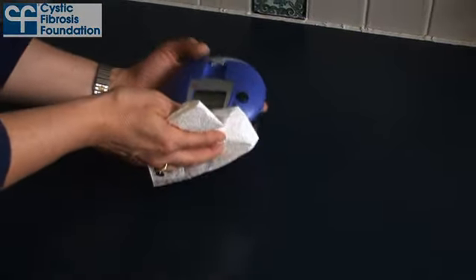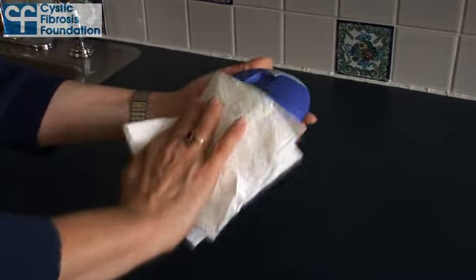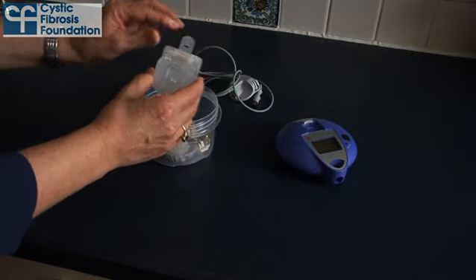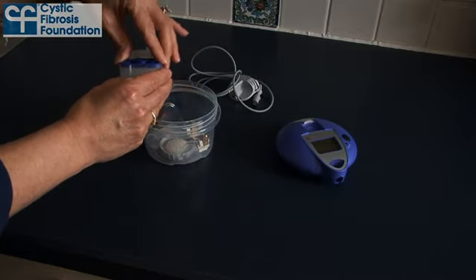If the controller needs cleaning, wipe it down with a slightly damp soft cloth. Do not allow liquid to get inside the controller. Wait to reassemble your nebulizer until just before your next treatment. This ensures that the silicone seals do not become warped over time.